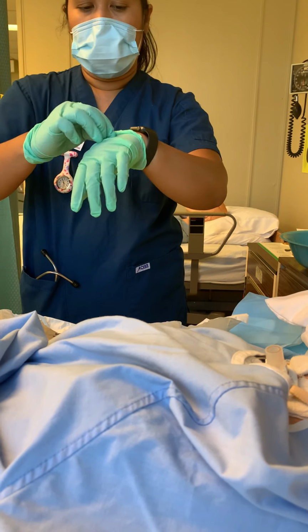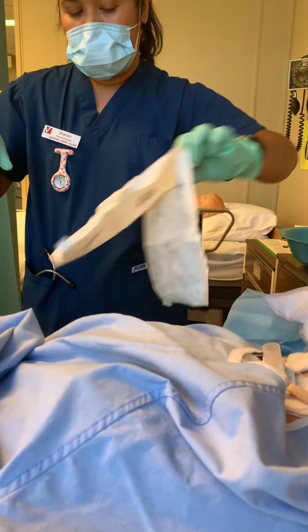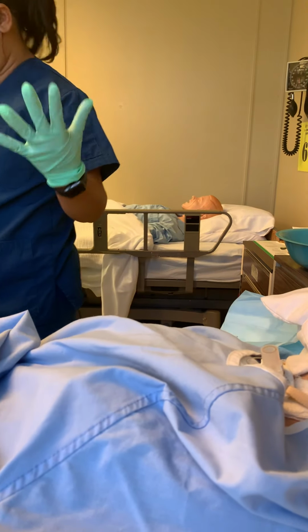Just leave it from here. Inside you cannot touch your skin. Now this one, just drop it in the garbage. Do not put your hand down all the time, remember?